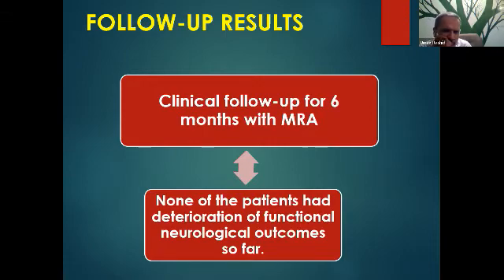Generally, we face this problem in large aneurysms. Large aneurysms, we have found some recurrence rate, and in those cases, we have recoiled.